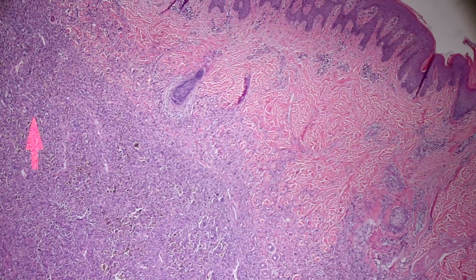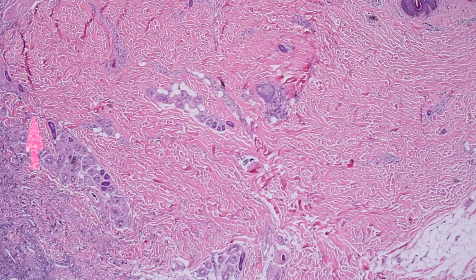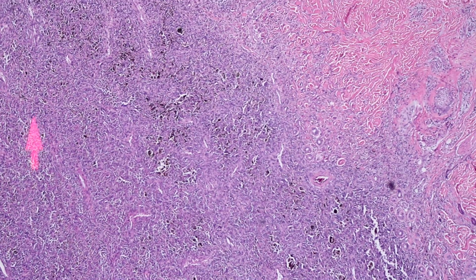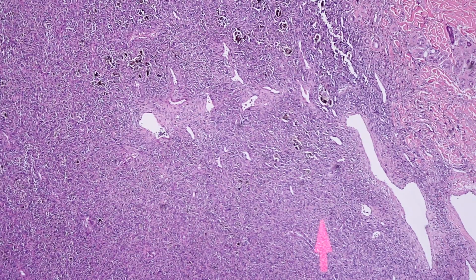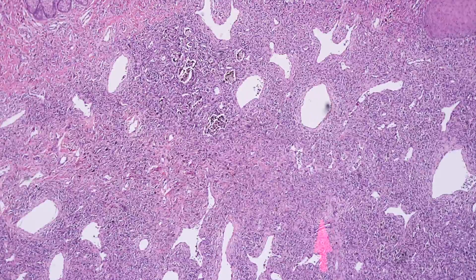And see, from lower power you can see this is towards the edge. There's normal dermis over here, and here's the tumor. It's at this interface between the tumor and the normal dermis, particularly up in the top of the lesion, that's where you usually see that collagen trapping, okay? All right, fine. Let's go look at the cellular tumor itself.